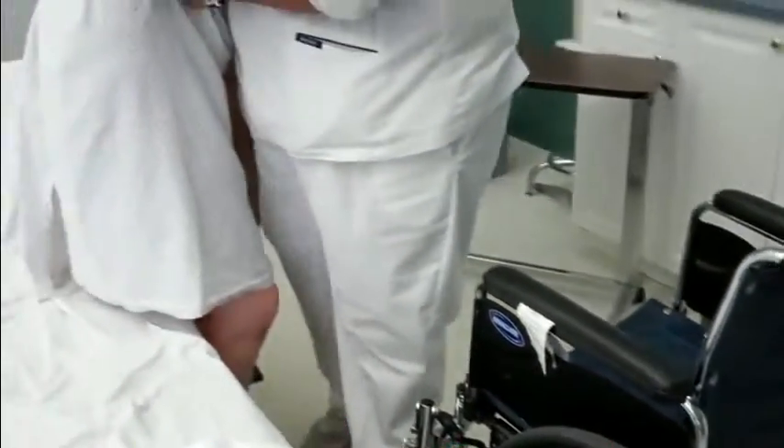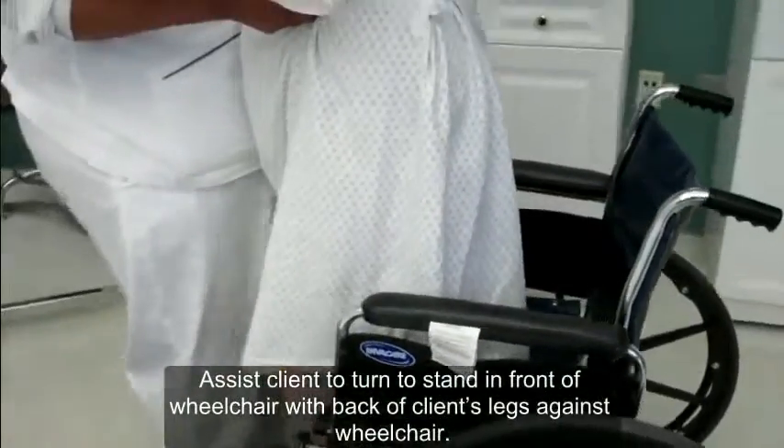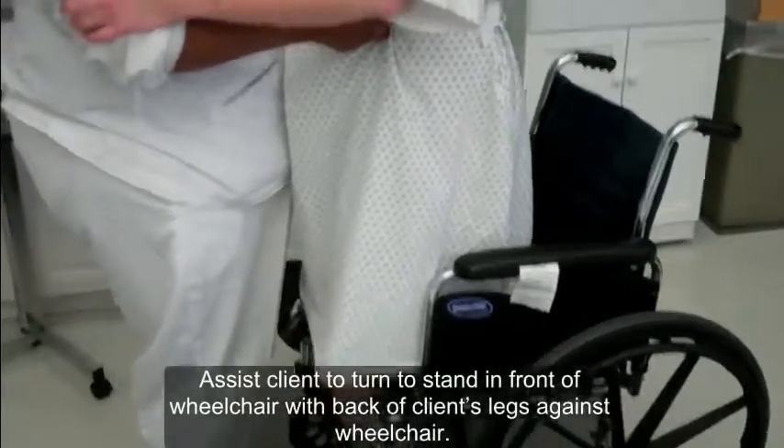We're going to move over now. One, two, three. Do you feel the chair in the back of your legs? Yes ma'am. Okay. Very good.